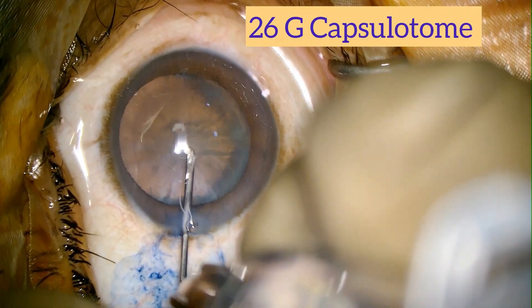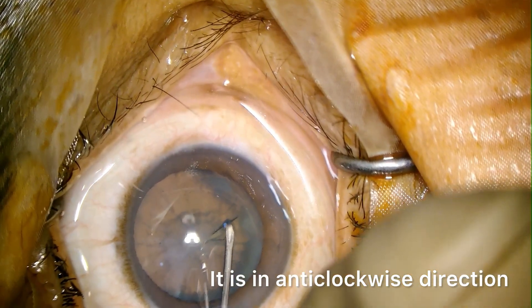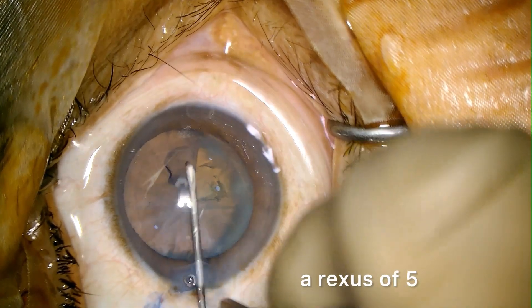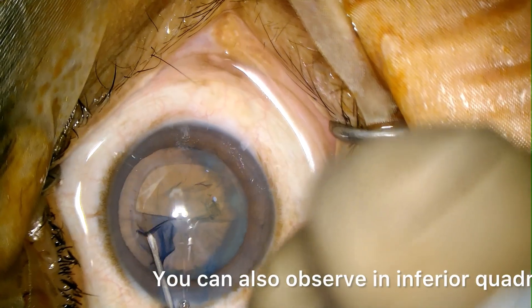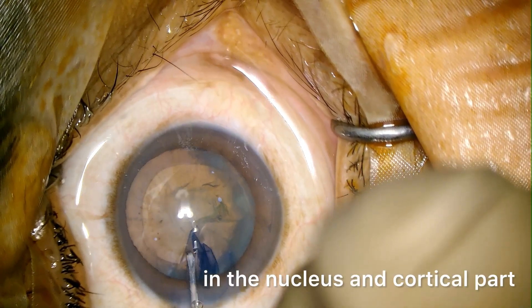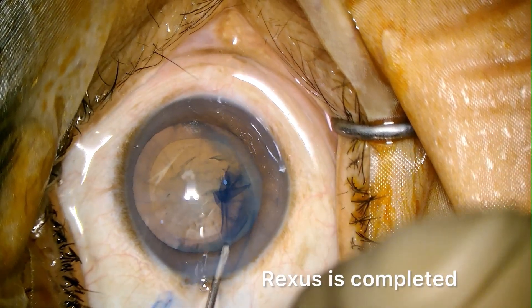We are using a 26-gauge needle for capsulotomy. It is in anti-clockwise direction. We are trying to have a rhexis of 5 mm. You can also observe in the inferior quadrant there is some calcification in the nucleus and cortical part. The rhexis is completed.